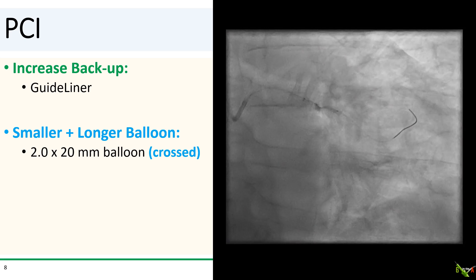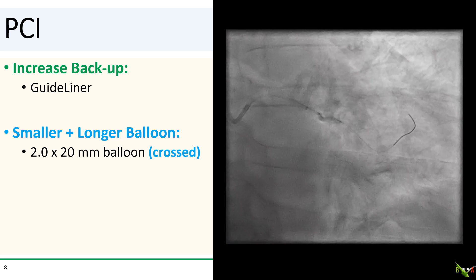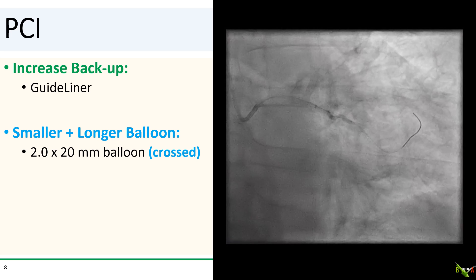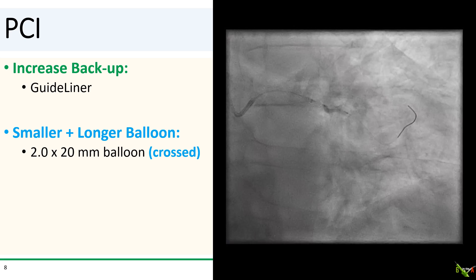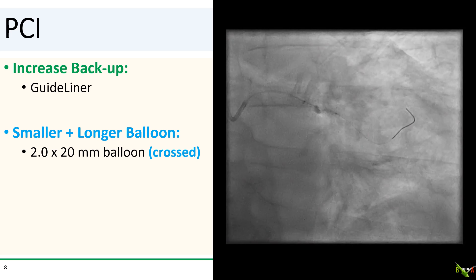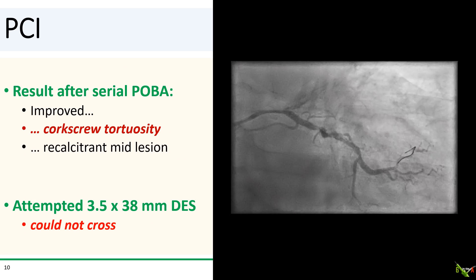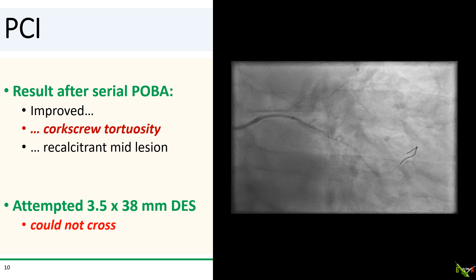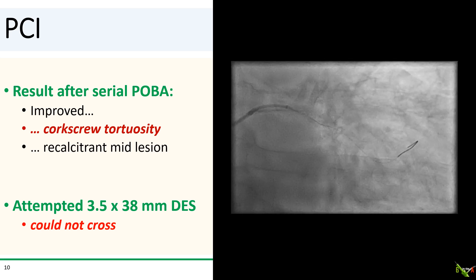So we followed the algorithm and got a guideline in there to increase our backup. We chose a smaller and longer balloon — a 2.0 by 20 mm compliant balloon — and with a little bit of a push we were able to get the balloon to cross. You can see that the vessel has a bit of a kink in there, and that probably prevented the larger 2.5 balloon from crossing initially. We then did serial dilations with 2.25 and then 2.5 mm balloons to size up the lesion and prepare it for the stent. After POBA, the lesion looked better, but there does appear to be a corkscrew or tortuosity with a focal recalcitrant spot right in the middle of the lesion.